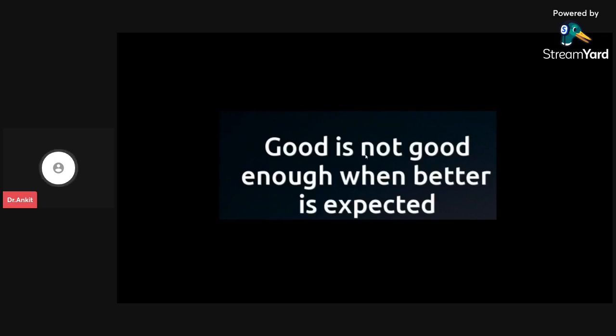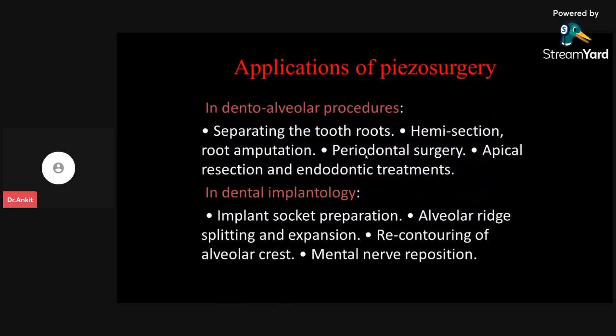Okay, so is it all good for the piezotome, or is there anything which is not there in the piezotome? So I would say there are obviously some drawbacks to it, and let us discuss them accordingly. Before that, we will see the application of piezo surgery. What is that piezo surgery?